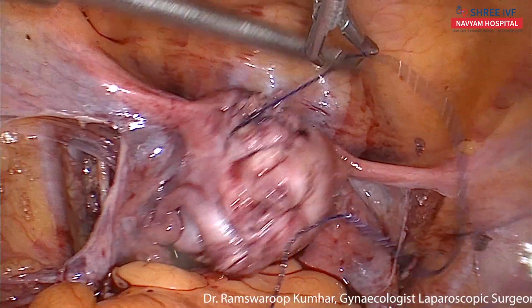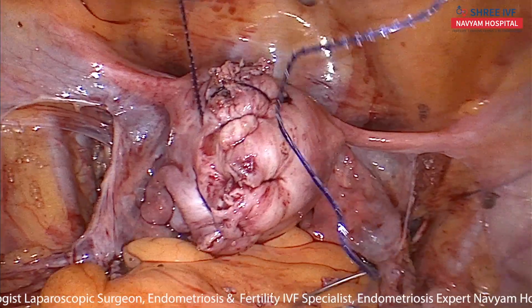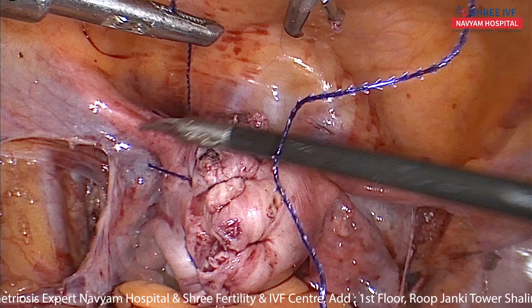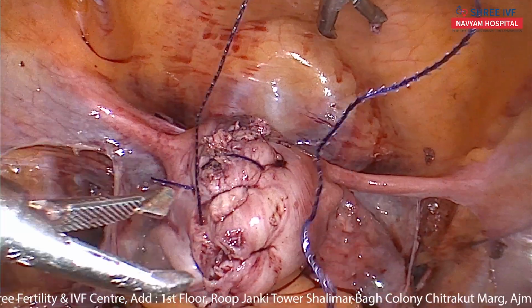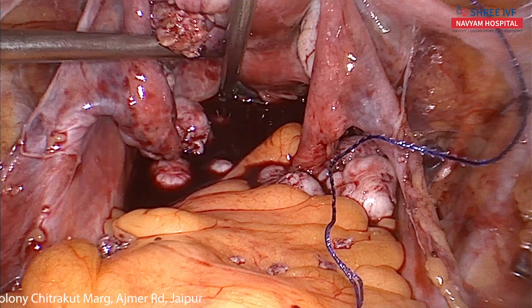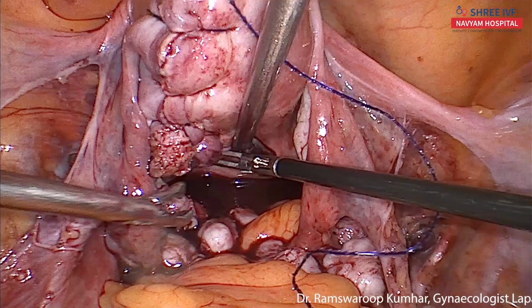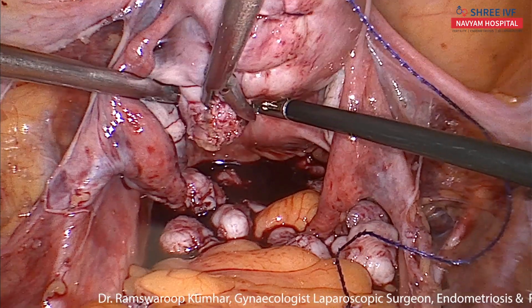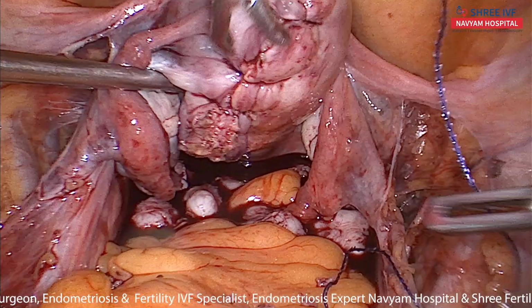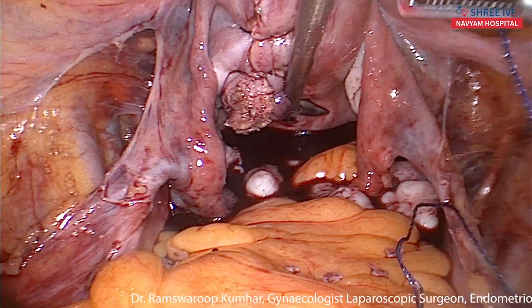Okay, sir? Yes, sir. There are so many fibroids and only a poor little lovely uterus is left. Fallopian tube is damaged on the left side. But what can we do? I think we should take one more stitch here or not. Although the hemostasis is good. Not needed. Everyone is feeling no need. It's okay.